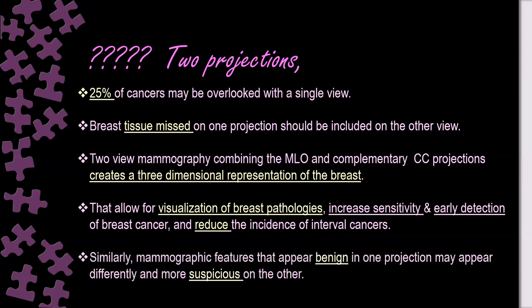Similarly, mammographic features that appear benign in one projection might appear suspicious on the other.